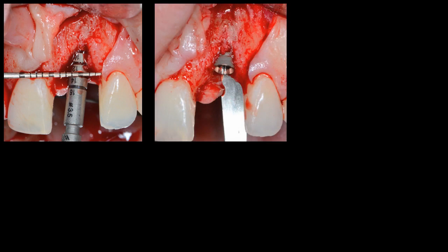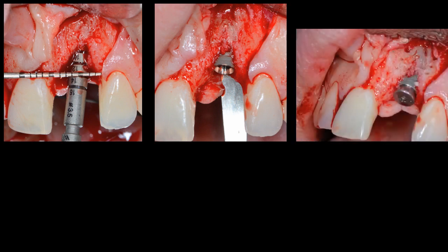The implant was placed accordingly also to the adjacent cemento-enamel junction. Here the bone is about 3 millimeters away from this cemento-enamel junction, so a bit more, 4 millimeters here. So we placed the implant only 2 millimeters away from the cemento-enamel junction, as you can see here. Some of the implant threads were exposed, and we then decorticated the bone, knowing that of course we had to graft on top of that implant.